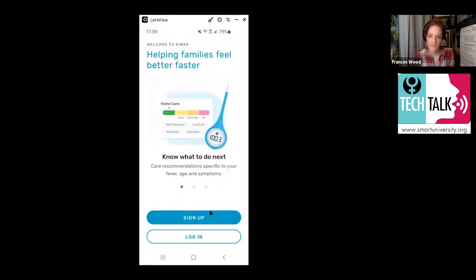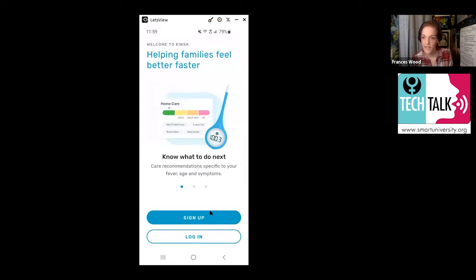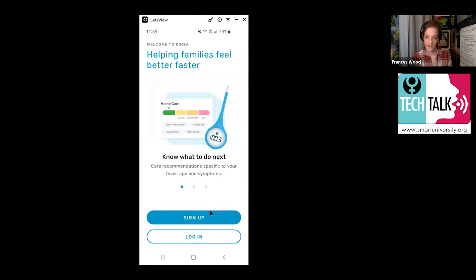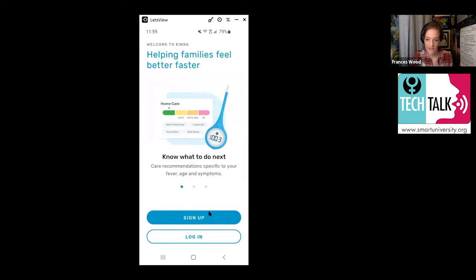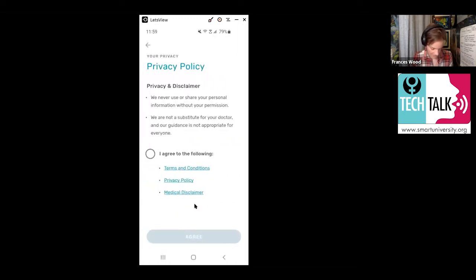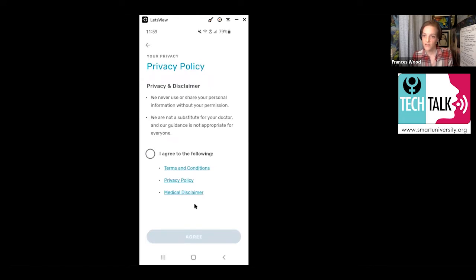So you're going to open the Kinsa app and this is what you should see. It's asking you to sign up or log in. Because we're assuming you don't have an account yet, you're going to say sign up. So you're going to click on this button that says sign up. And once you do that, this is the screen that you should see.